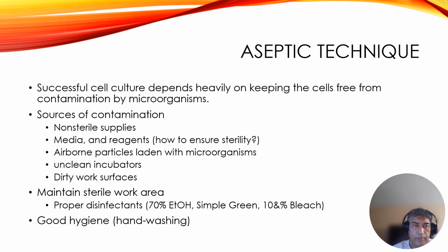Common sources of contamination are non-sterile supplies, media and reagents, airborne particles laden with microorganisms, unclean incubators, and dirty work surfaces. In my practice, I usually keep my media and reagents separate. I won't share any of my cell culture medium, FBS, antibiotic, and other additives that I routinely use. If someone needs them, I provide a separate aliquot from fresh stock.